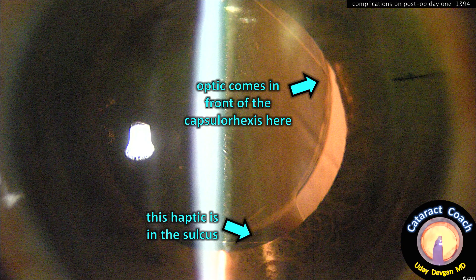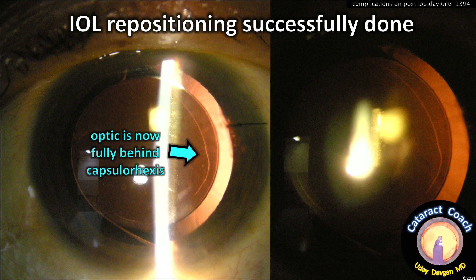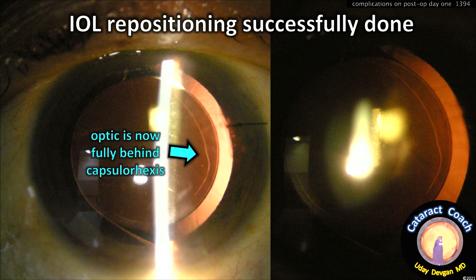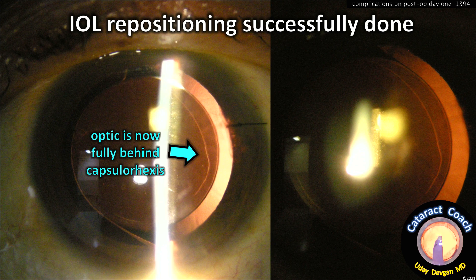On post-op day one, that bulge behind the iris is the haptic. The red arrow marks the spot where the lens optic is coming out of the capsular bag because the subincisional haptic is in the sulcus. Don't leave this — reposition on post-op day one. On the slit lamp you can see the optic coming in front of the rhexis. After repositioning, the rhexis now fully overlaps 360 degrees. Never leave a haptic in the sulcus, or you'll get UGH syndrome — uveitis, glaucoma, hyphema. Be vigilant on post-op day one.